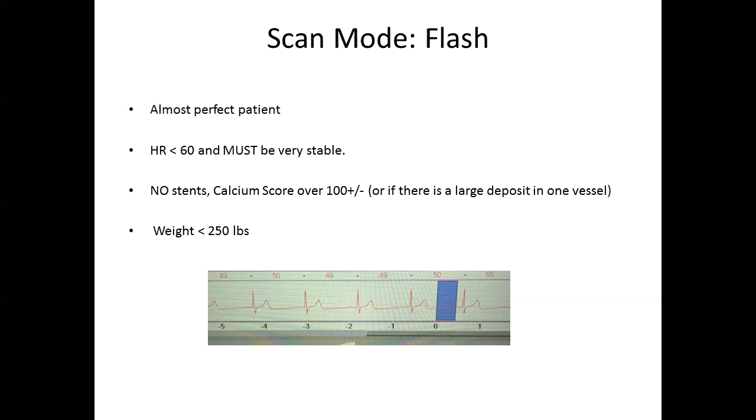The nice thing with this is it eliminates any breathing motion artifacts, which is a problem because of the breath hold, because you're done in a single heartbeat. So you're freezing cardiac motion and breathing motion with that.